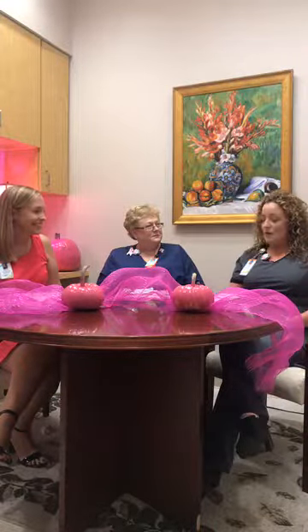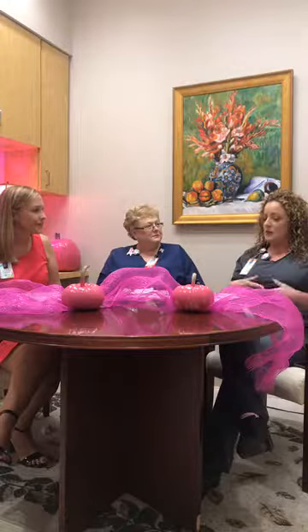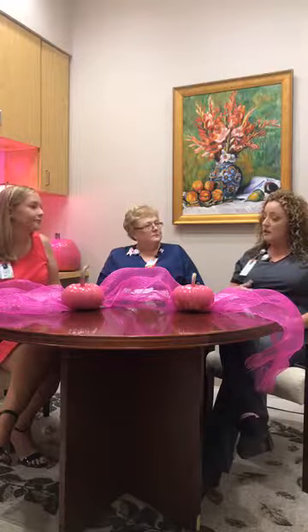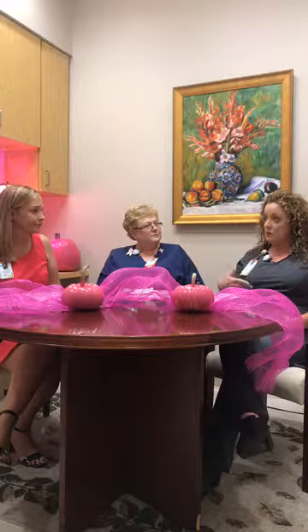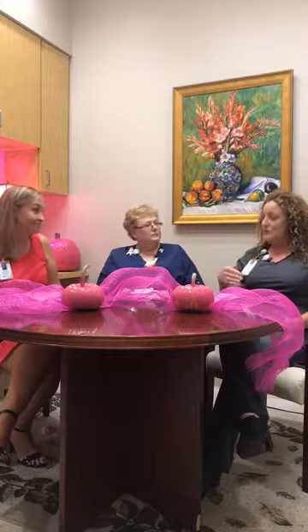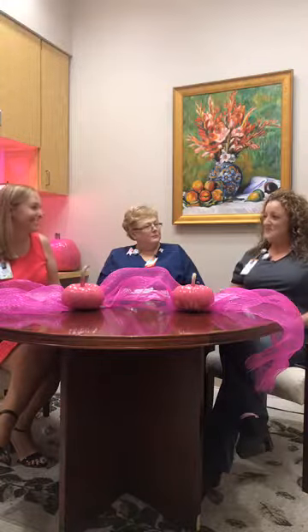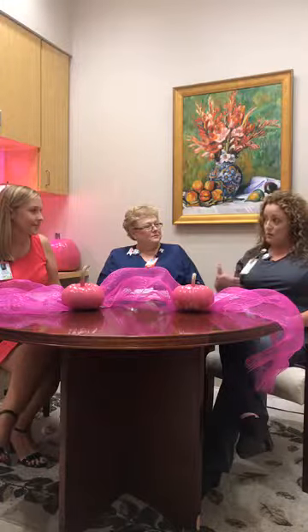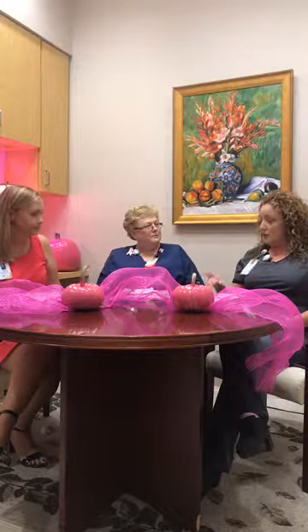But compression-wise, most of the time, if you can talk yourself into relaxing, that's going to help a lot because your breast tissue lies directly in front of your muscle. That muscle, I'm trying to include that in my pictures, because when I include that on my picture, the radiologist knows I have all your breast because it's directly behind it. If that muscle's balled up and tight and tense, it's going to pinch worse. So shoulders down, blow it out, try to relax. I get better pictures and yours is a much more comfortable procedure.